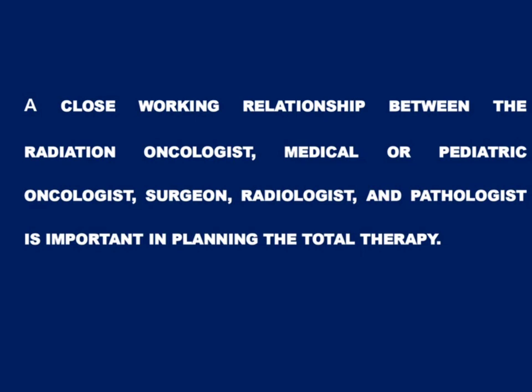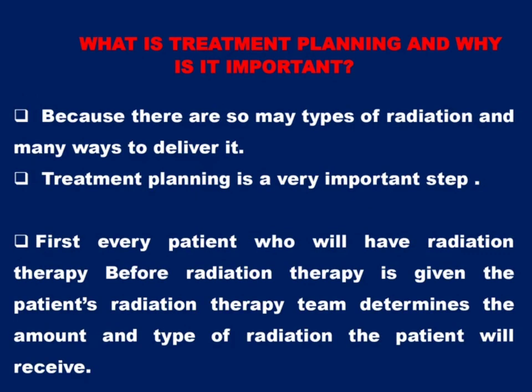This is forward planning and allows the doctor to more precisely target a radiation beam, including the width, height, and depth. Because of a CT scan, you can get a depth as well. Many radiation oncologists use this technique. It has been proved that CT-based planning improved 5-year overall survival for all cancers by 3.5%, and was particularly more useful when the tumor volume is very small.